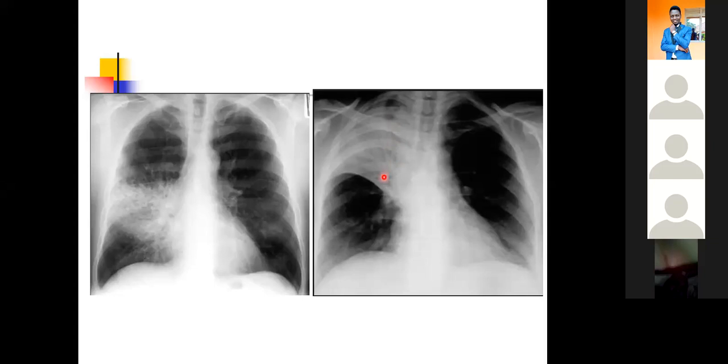Some black tubular structures or features, and you can see that as they move towards the peripheries of the lungs, they are also tapering. That is what we are referring to as air bronchograms.